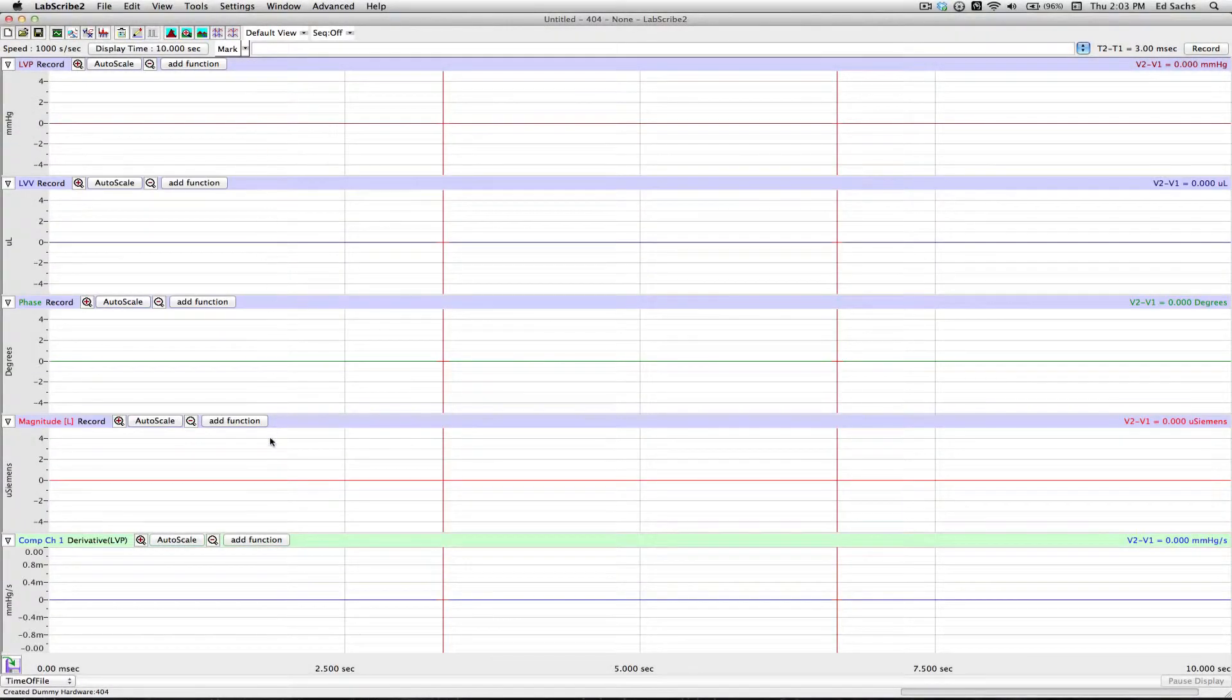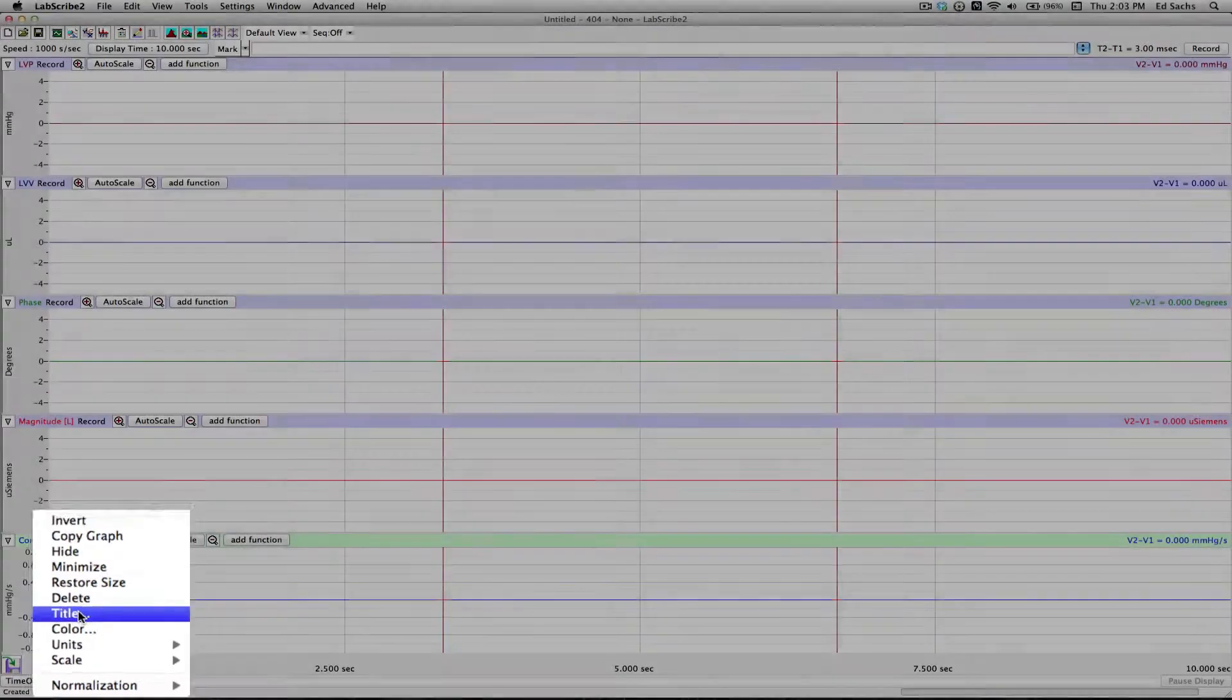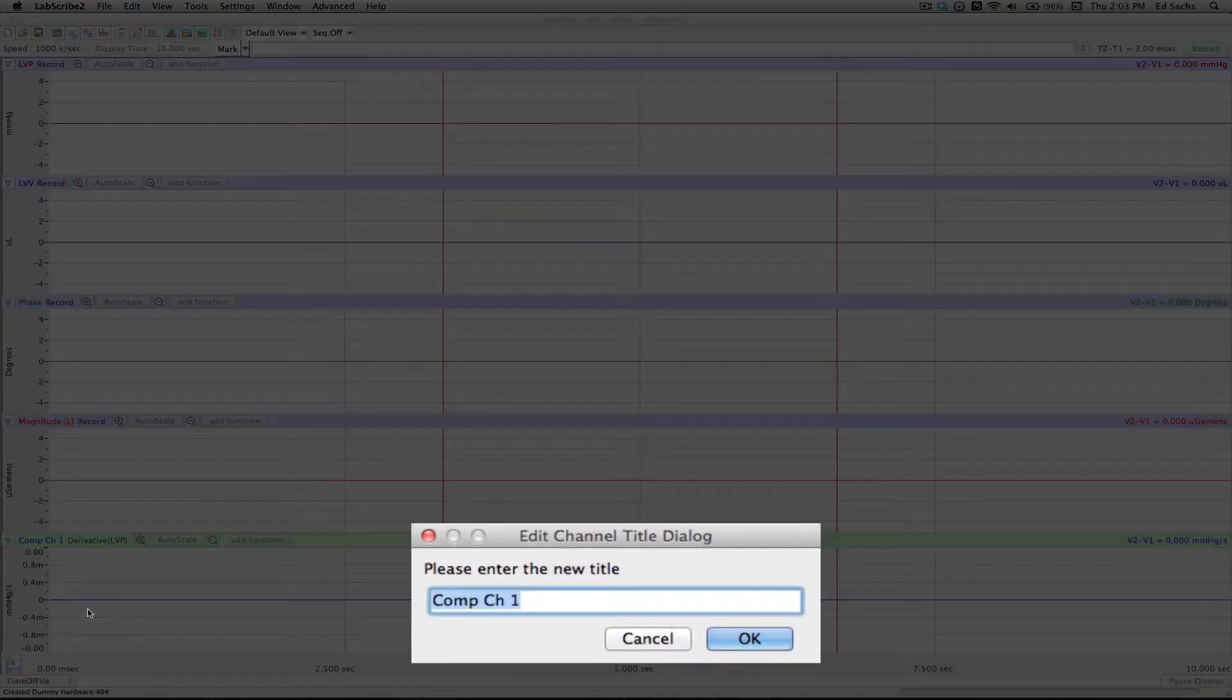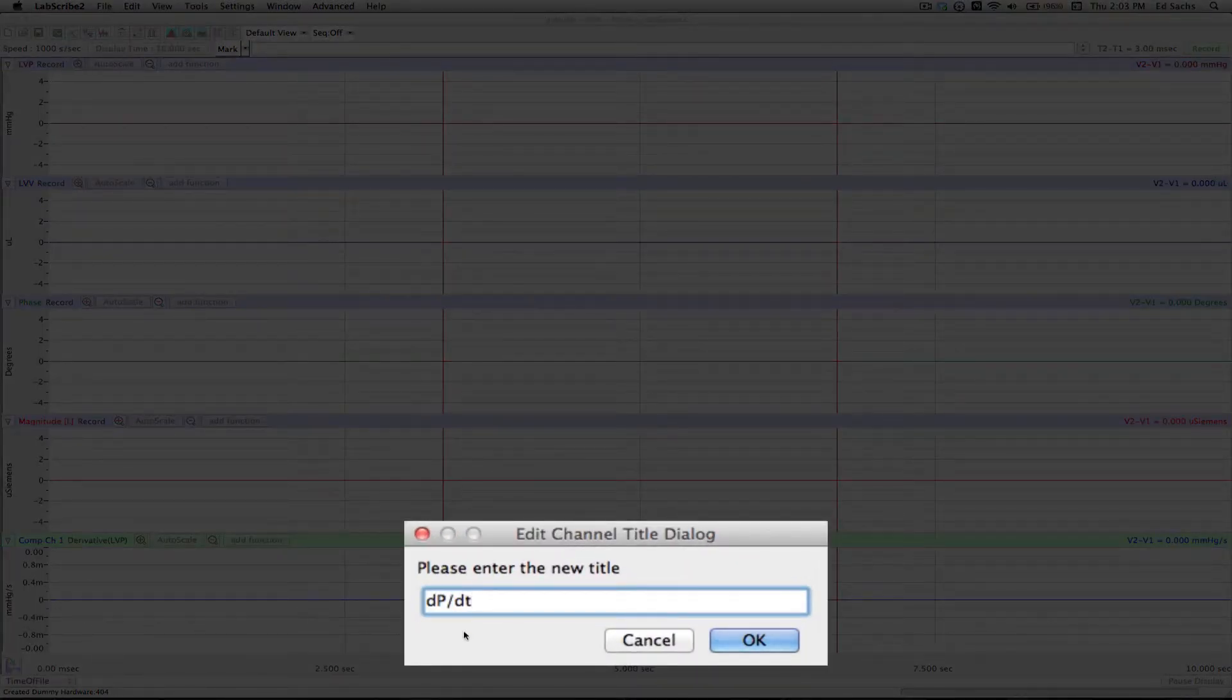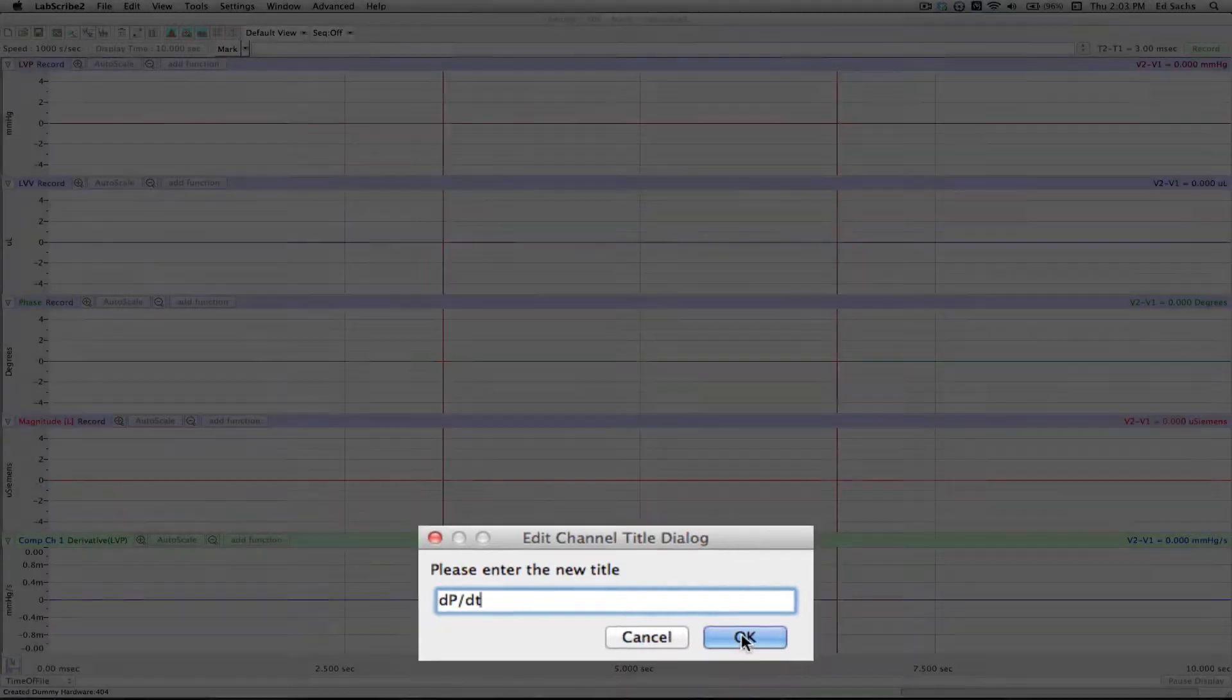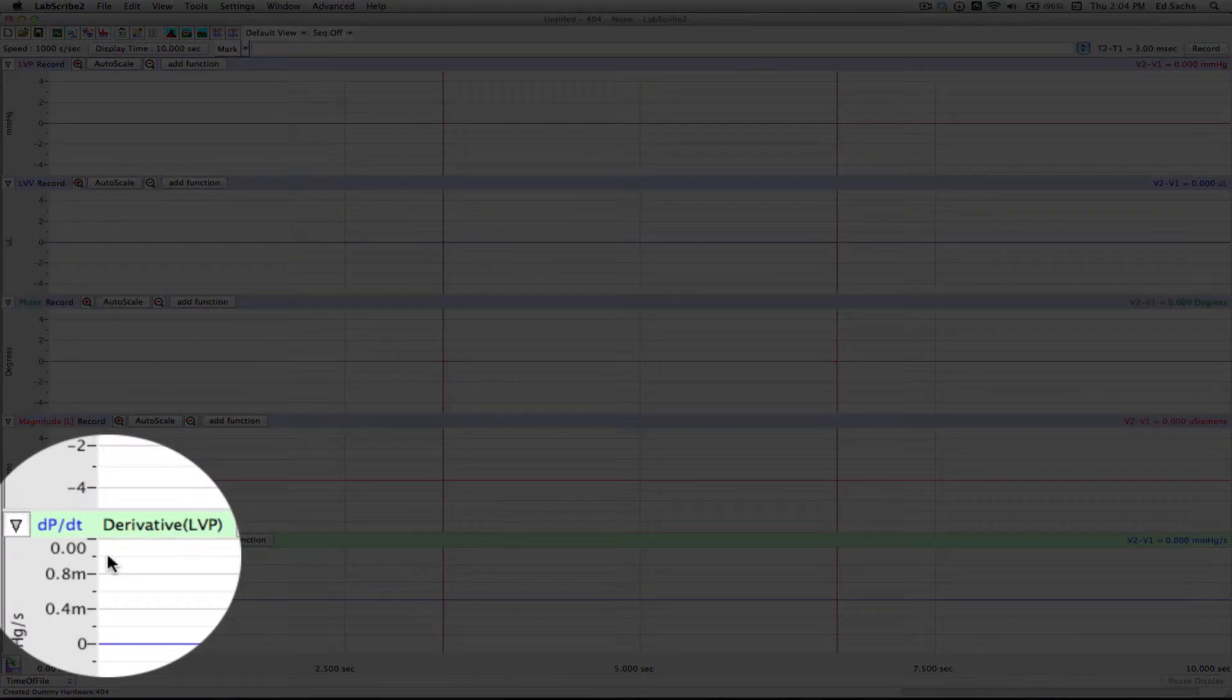The green channel that's been added to the bottom is the Calculated Channel. I'm going to right-click, go to the title, and I'm going to change that to DPDT. I hit OK, and now that channel's set up.